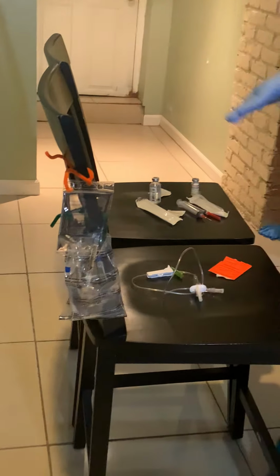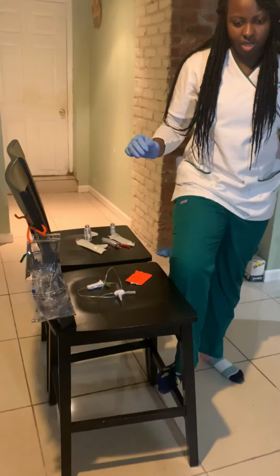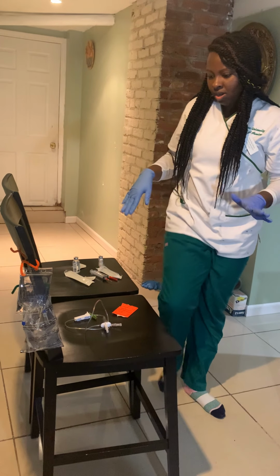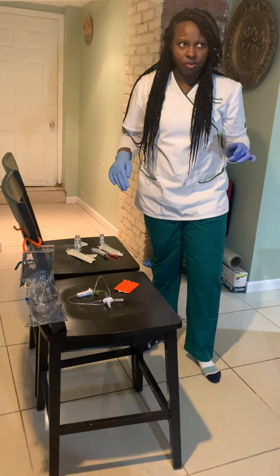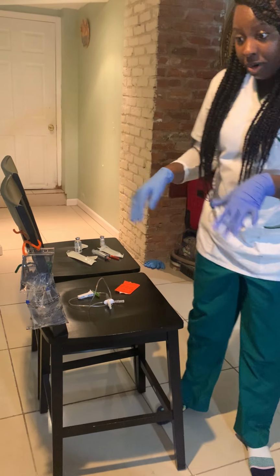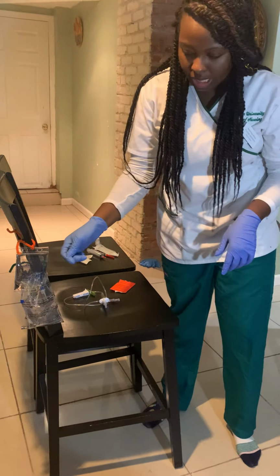So another step is for the Y port. I'm going to wipe off the Y port that's connected to the patient, making sure that aseptic technique was done.